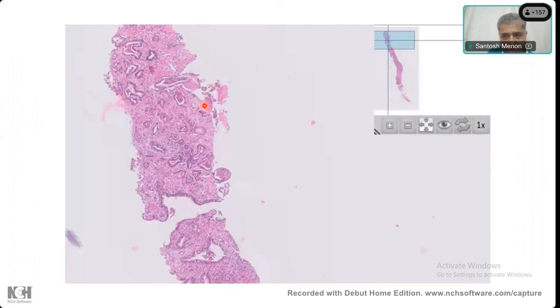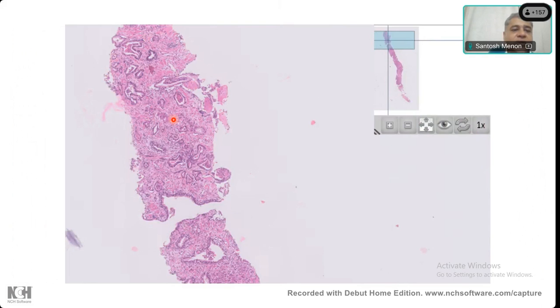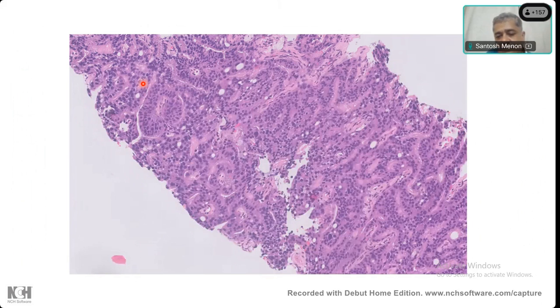The same core, if you look, this is the same core. The upper end of the core has got cancer. Okay, fine. And then this patient again had probably more cancer. I think this is from the same or maybe from a different case. So anybody wants to score this, Gleason scoring?